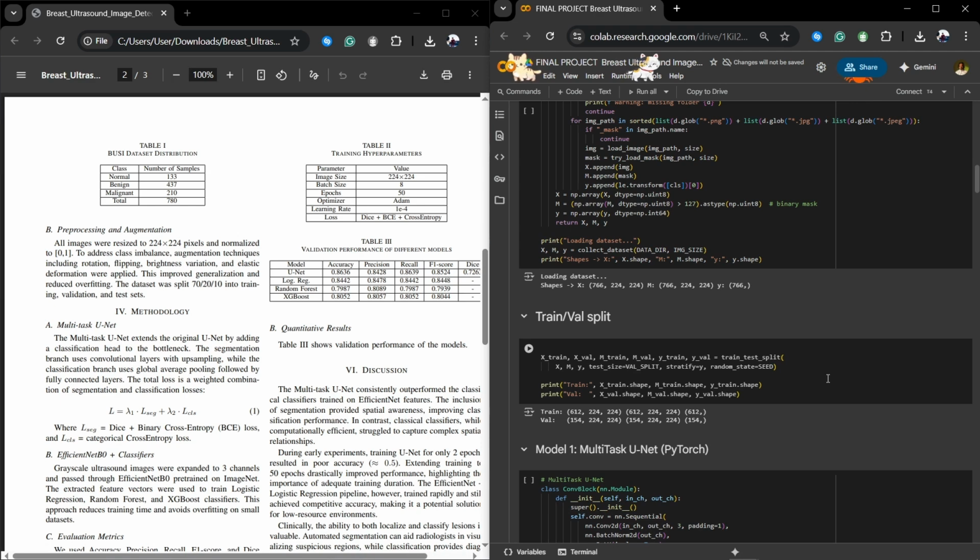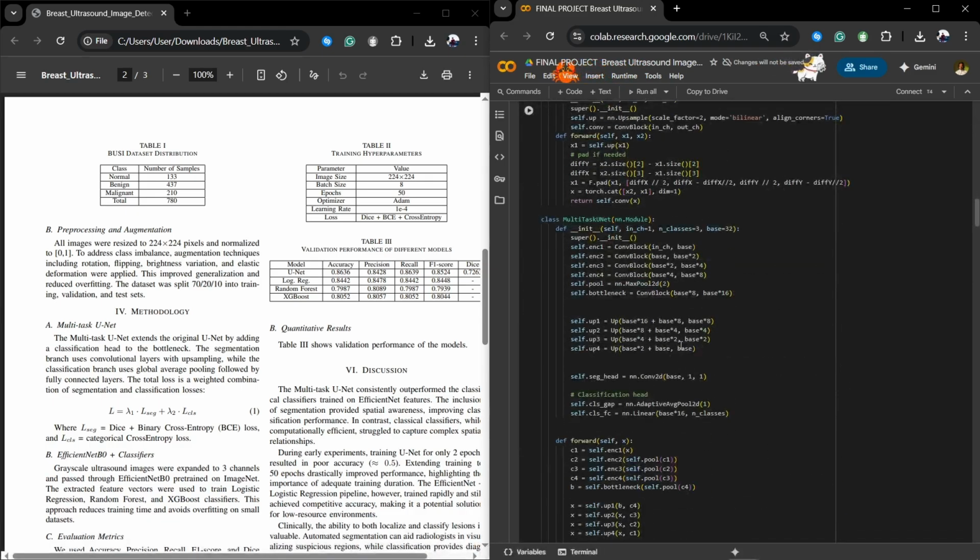Also, I created the training, validation and test splits: 70% training, 20% validation and 10% for testing, and supported the hyperparameter tuning. I helped test different batch sizes and early stopping strategies to find the optimal configurations for stable training.